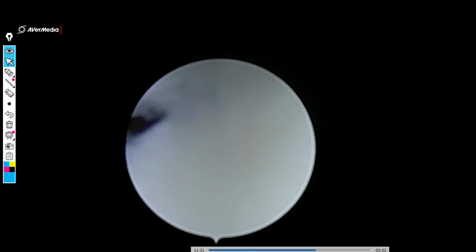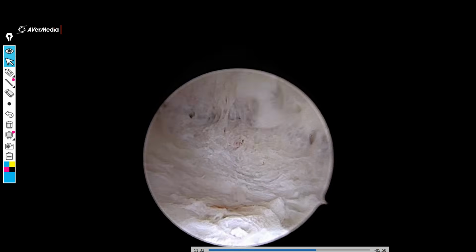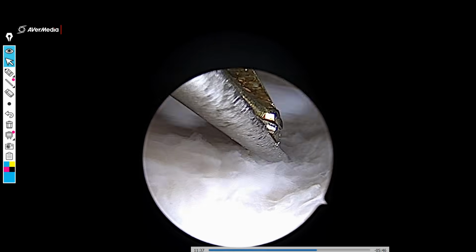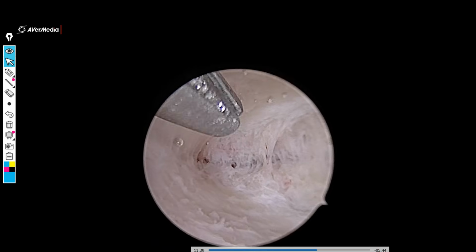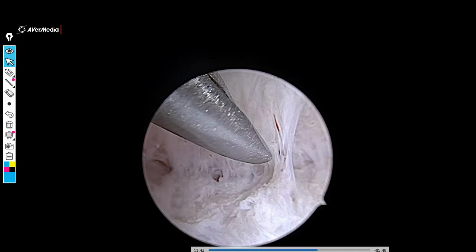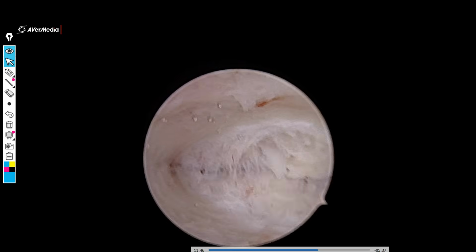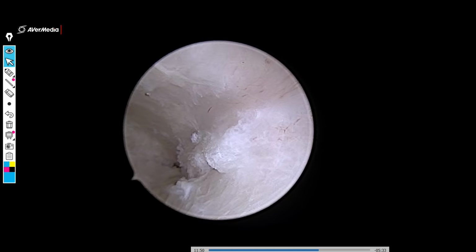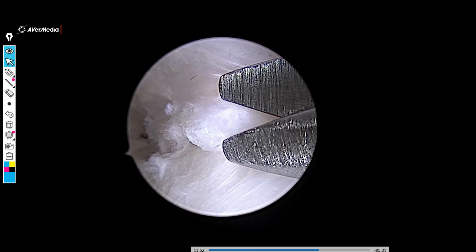You can see over here, however, that islands of endometrium are not many. So there are minimal islands of the endometrium, and we cannot promise this patient the world. We can tell them that you can expect a good return to menses. If she's completely amenorrheic, the menses will probably be better, but promising the patient that she will conceive with such extensive synechia may not always be possible.